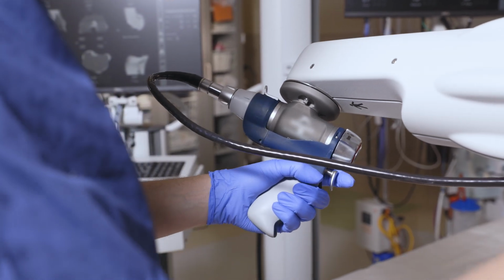Orthopedic surgeons at Mission Health have long offered advanced partial and total knee replacement surgeries. Now, Dr. Myron Smith says robotic technology is improving these procedures even more. It sounds funny. It's not like a robot standing there doing the surgery. It's a really fancy saw, but it's guided by information we collect during the surgery to help balance the knee. It gives us slightly more precise cuts.